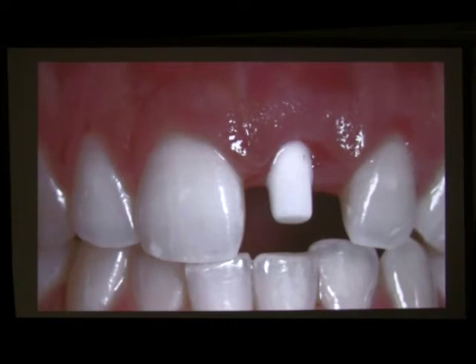The patient goes home with an ischemic reaction on the gum. We do composite around the coping, and we don't care where the gum is pressed underneath the coping, because the patient will come 2-3 weeks later. So we have control of the cement that it's subgingival.